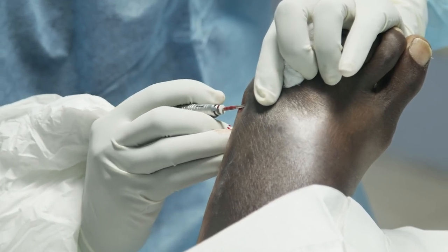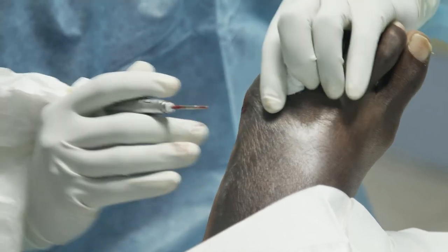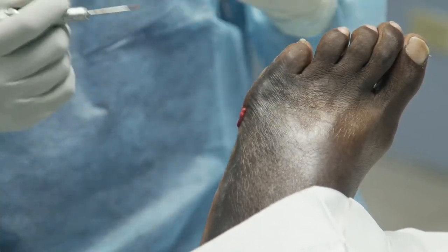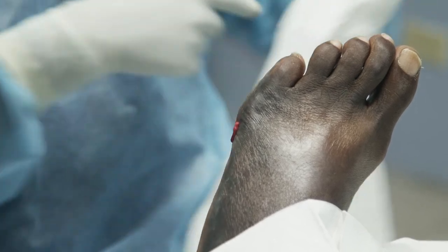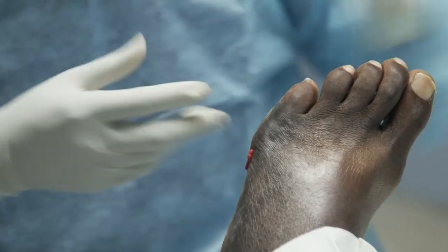And then Felicia's gonna give me a picture. Ding! You hear that? Ding! And guess what happens? So watch this now. As I shave that stuff, that's the burr, it's clean. So out of there now, I'm in the joint. So I'm not worried about hitting stuff anywhere, nothing going wrong, no dings, no trouble, no headache.